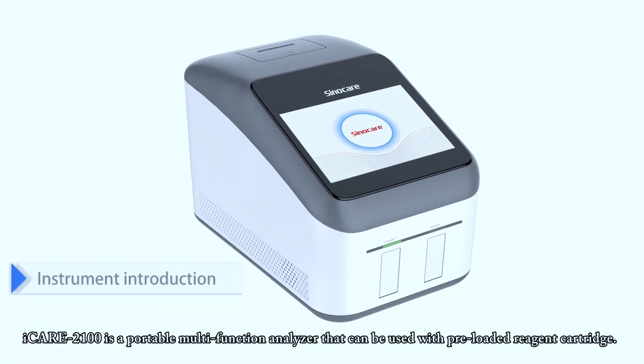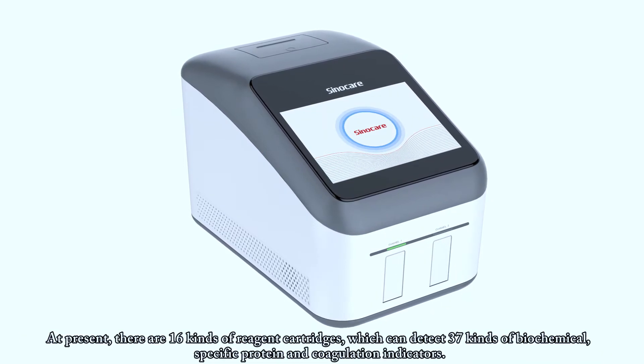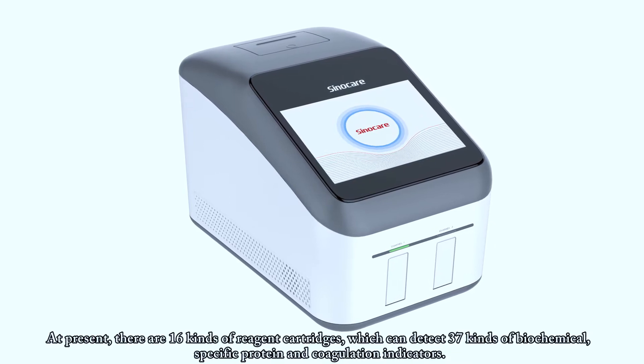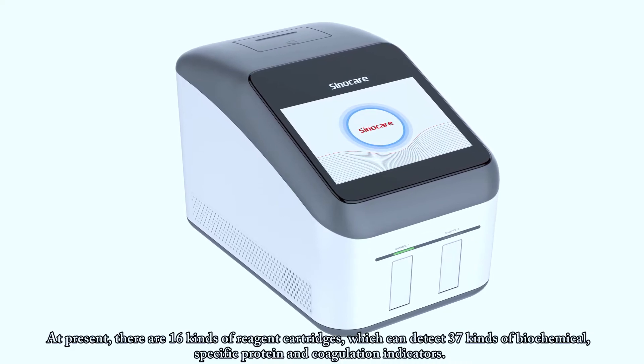iCare2100 is a portable multifunction analyzer that can be used with preloaded reagent cartridges. At present, there are 16 kinds of reagent cartridges, which can detect 37 kinds of biochemical, specific protein, and coagulation indicators.